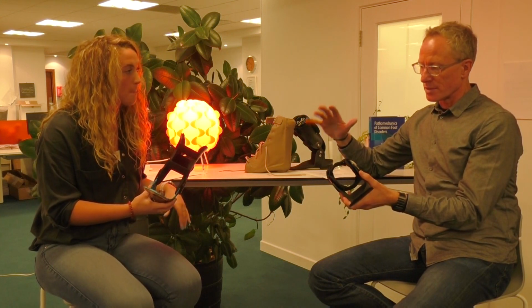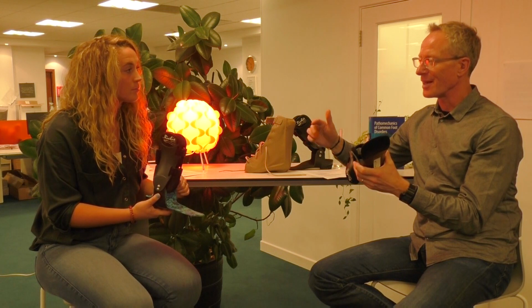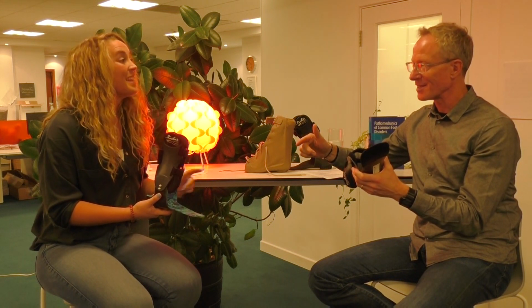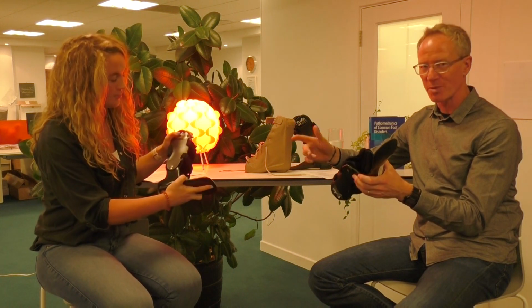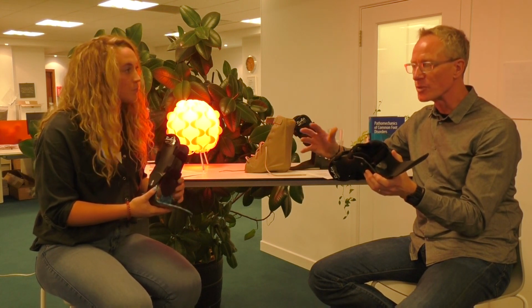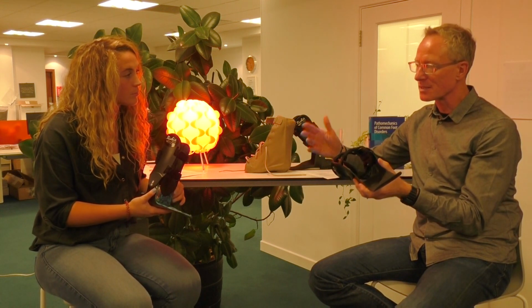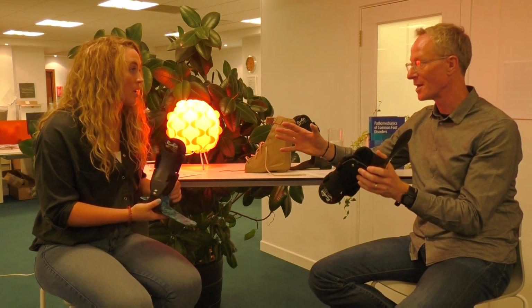Another thing that's important to note, when we say fixed hinge and limiting movement, it doesn't limit movement fully. Doug was chatting about that. This is 5 millimeters polypropylene. This is not a big, thick, solid AFO back slab. So you still get a degree of movement. The key thing is that it can offload painful structures, be they soft tissue or bone.